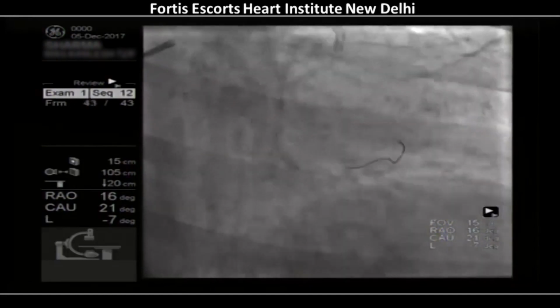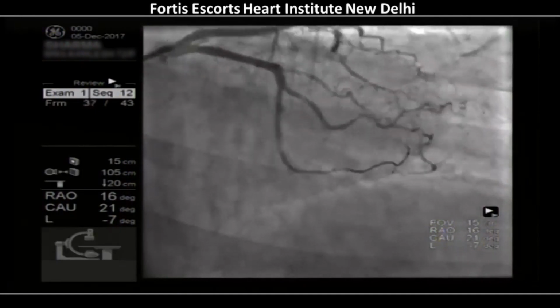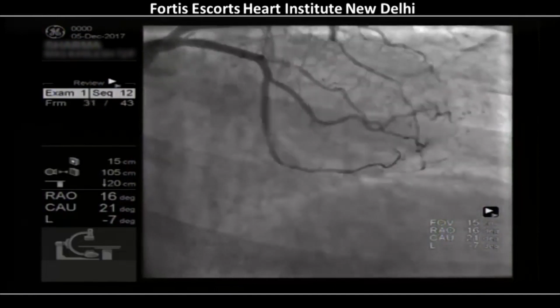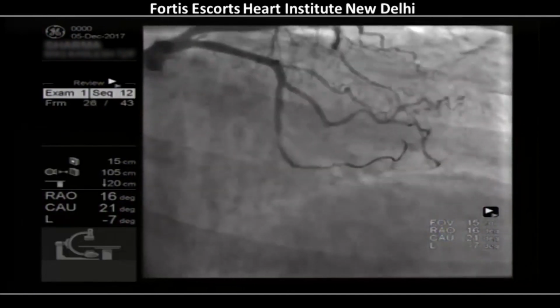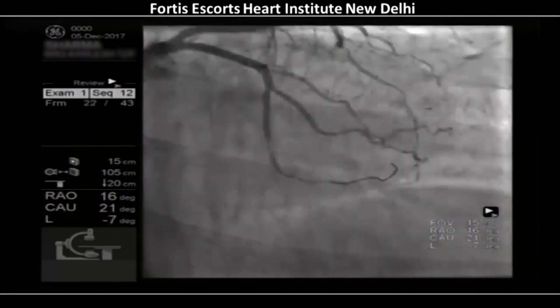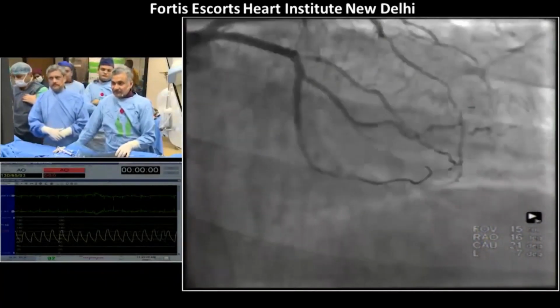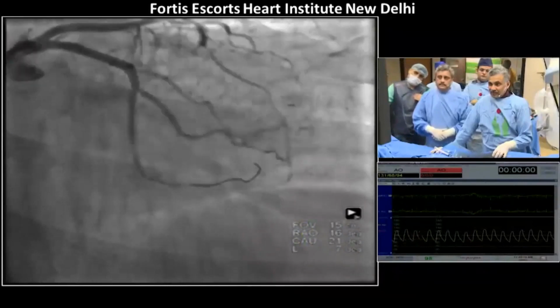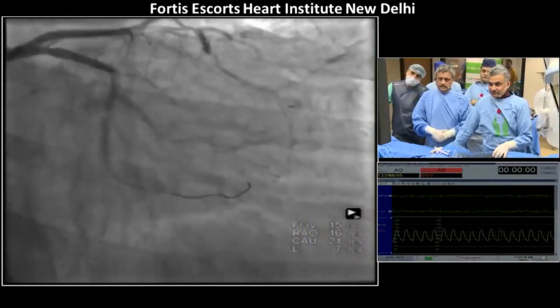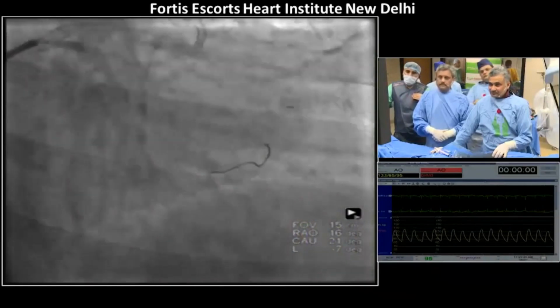I think we should post dilate the proximal stent with the 2.5 balloon, and then, because of the distal part, put another 2.5 stent to cover the dissected portion and uncover the rest of the vessel. I think if I recall the last procedure which I did about a week back, it was suggesting dilating this distal part of the lesion. We want you to expand the other stent and put a short 2.5 stent, and make sure you image it and don't leave an outflow dissection.